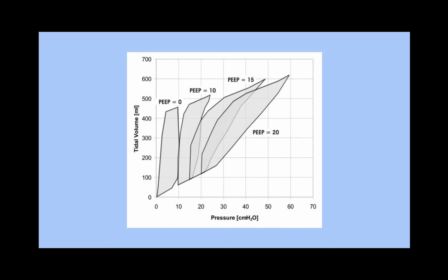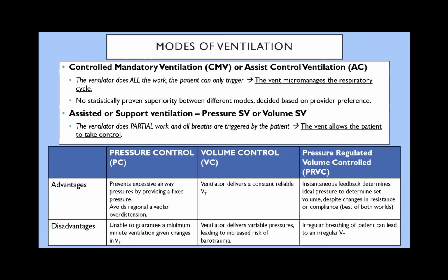So take into account that that's why for ARDS patients, we're always using very high PEEP to FiO2 ratios, because we know that the more PEEP we give to these patients, the more we're going to be able to recruit and ventilate these patients better.